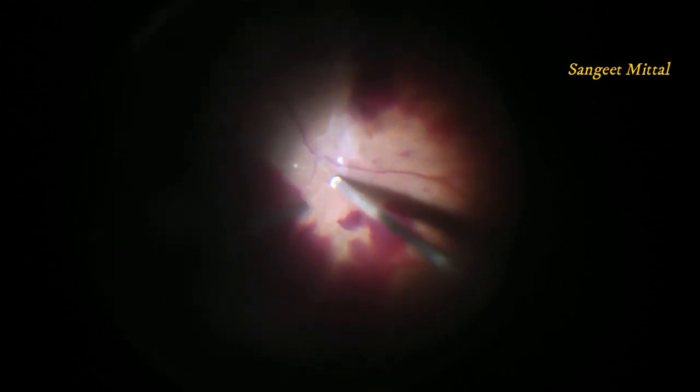The pre-retinal membranes in these eyes are sometimes associated with second membranes, which is said to be due to schisis of the posterior vitreous. Meticulous dissection of all these membranes is required to achieve a good postoperative result. After removal of epiretinal membranes, residual vitreous is removed.